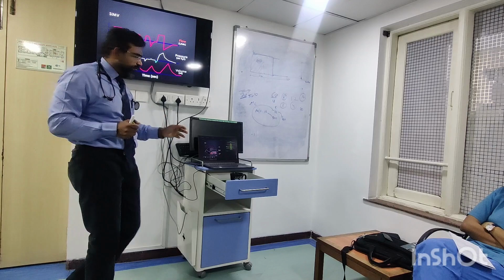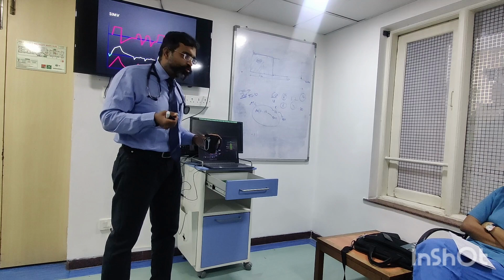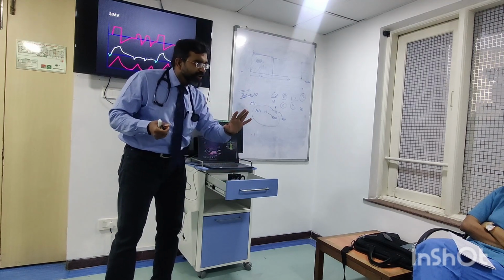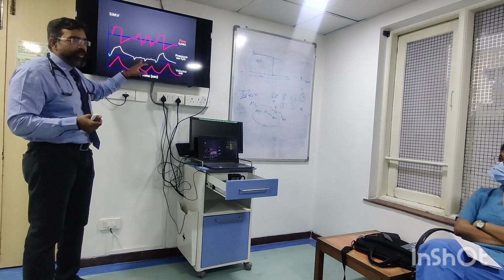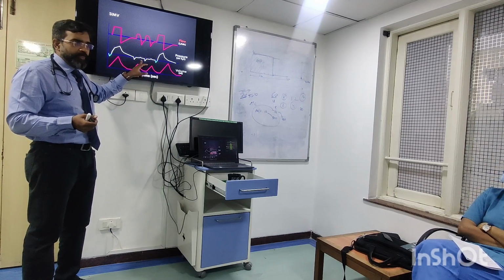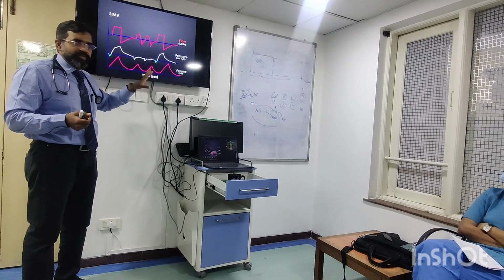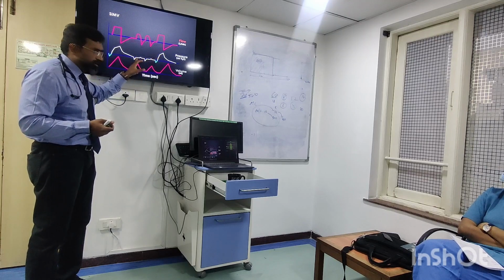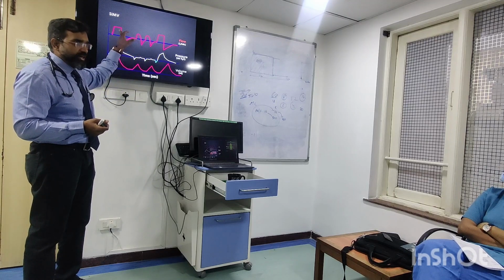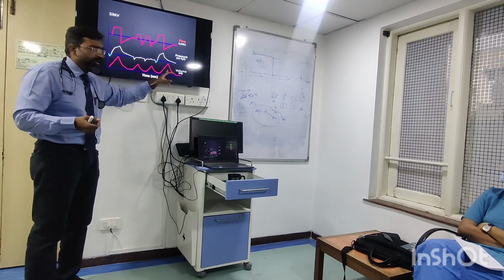So, what is the trigger here? There is no trigger. Whatever you call it, the patient is not triggering any breath. Where is the ventilator giving any breath? How does the ventilator deliver the breath? Is the mode, right? Is the ventilator delivering any breath here? It is only allowing him to breathe. So there is no trigger, there is no limit, there is no cycling. There is no trigger, because the ventilator is not giving any breath. If the ventilator were to give a breath here, it will look like this. Flow will start inside. Pressure will go up. However, we have decided the volumes will go up as per what we have mandated.